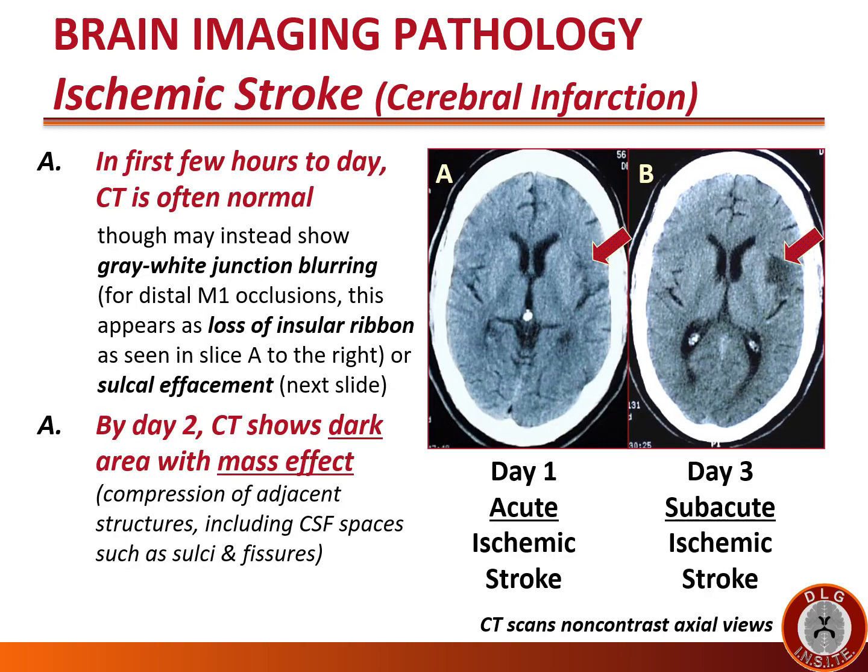Now let's look at the appearance of ischemic stroke or cerebral infarction on CT scan. In the first few hours to a day of ischemic stroke, the CT is often normal, though it may show gray-white junction blurring or sulcal effacement. For distal M1 occlusions, gray-white junction blurring appears as loss of insular ribbon. By day two, CT will show a dark area with mass effect and compression of adjacent CSF spaces such as sulci and fissures. This is how one differentiates a subacute infarction from a chronic one — in the subacute phase there will be local mass effect and compression of sulci, whereas in a chronic infarction the adjacent sulci will be bigger and wider due to atrophy.